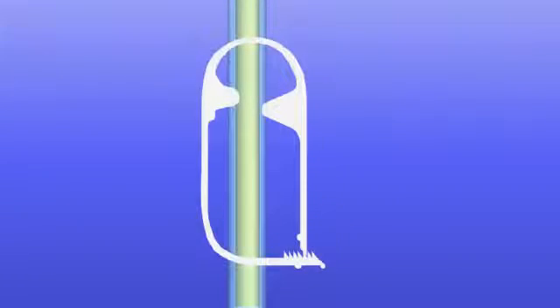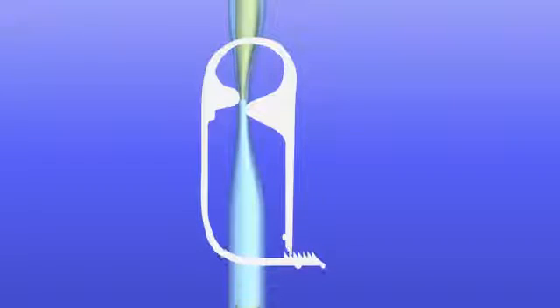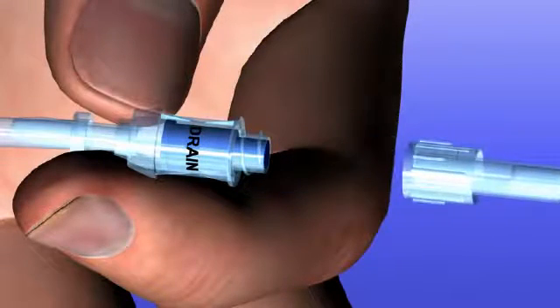When the flow stops or the bottle kit appears to be nearly full, close the drain line by squeezing the pinch clamp completely closed. Disconnect the drain line from the valve.